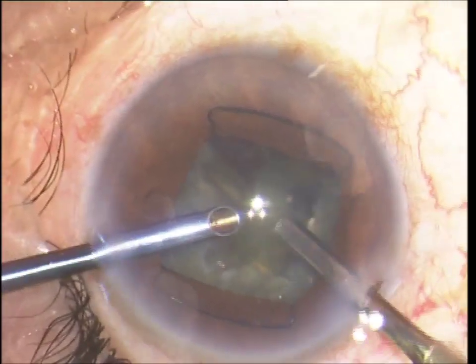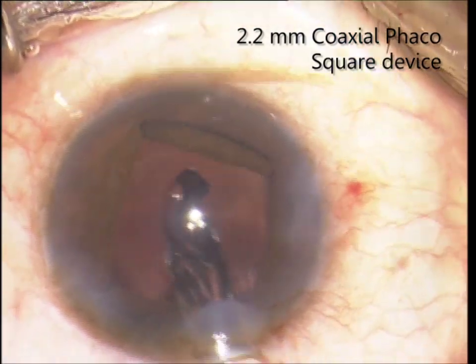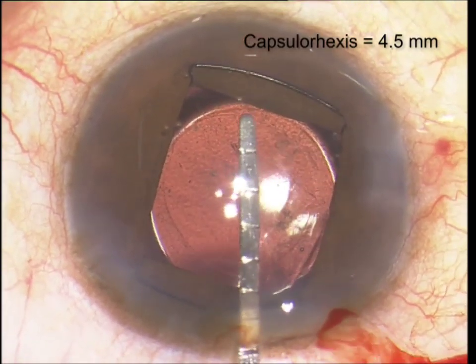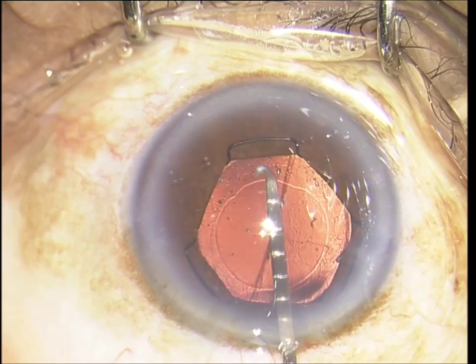1.4mm bimanual MICS being done, and this is a 2.2 coaxial phaco with wound-assisted IOL delivery. Pupil and capsulorhexis size are measured. Hard cataract, 2.2 coaxial phaco, hexagon device, pupil and capsulorhexis measured.